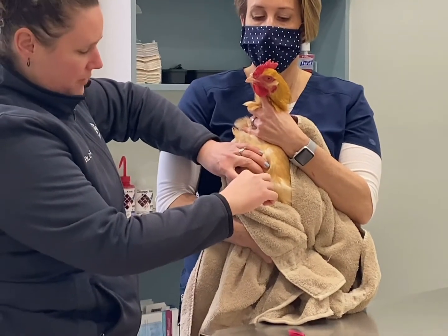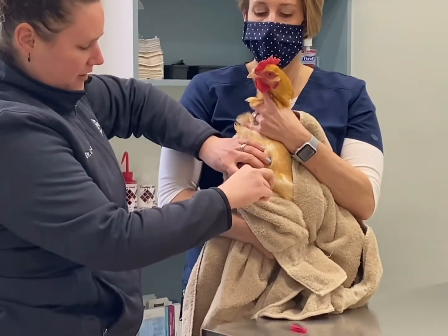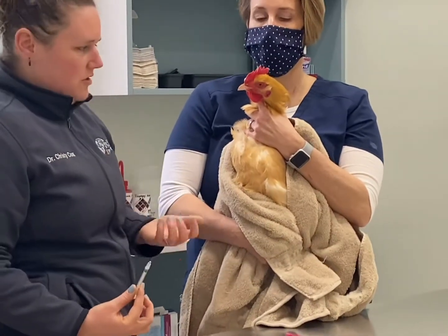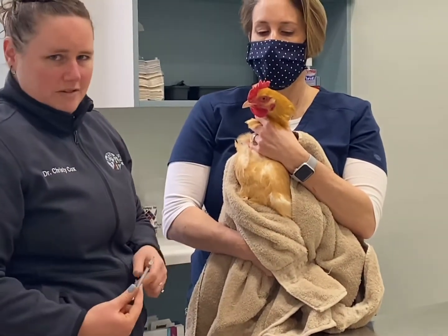If you get blood, just redirect — come out and back in. If not, then simply inject and pull your needle right out. Most chickens, once you get them up and held, are very receptive to that injection.